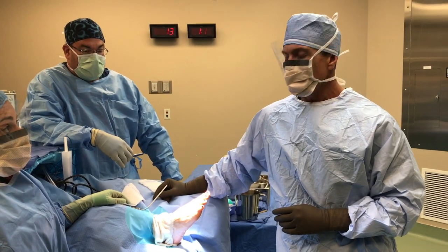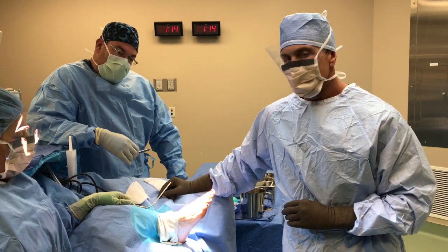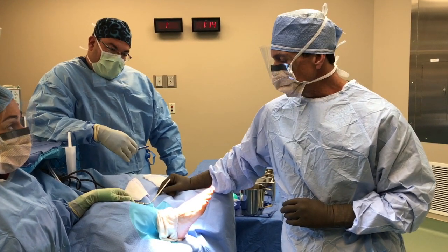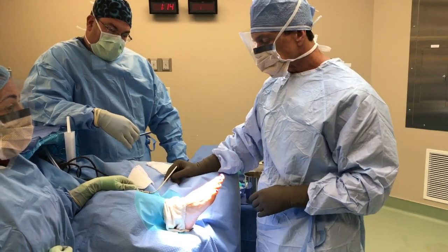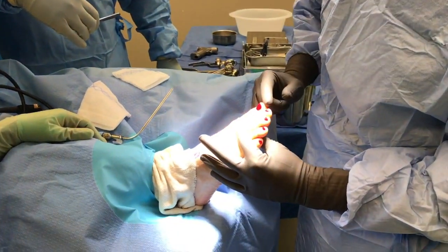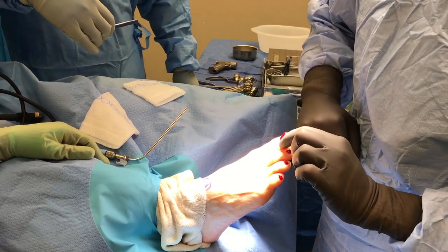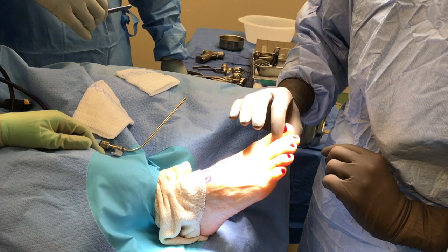Hi, this is Dr. Moore, and today we're going to perform a toe shortening and cosmetic digital surgery on this young lady. You'll notice that the second and third digits are a little bit longer than the first. They push up on the shoe, and then they rub on the shoe and form these slight calluses or corns.